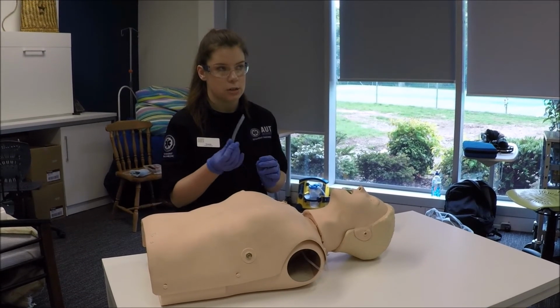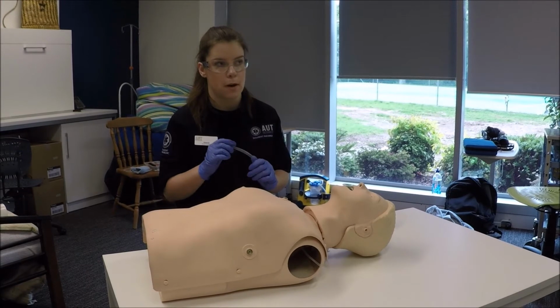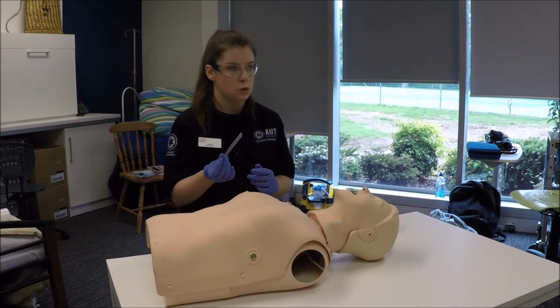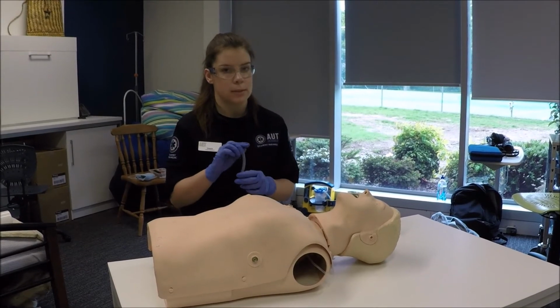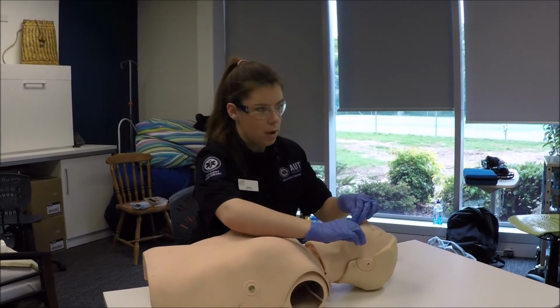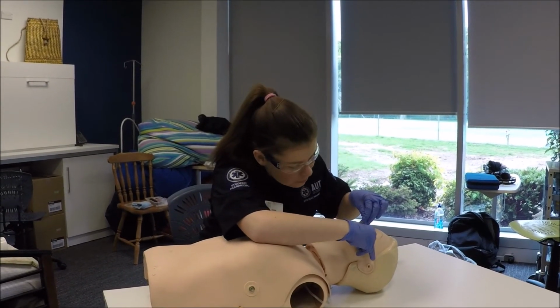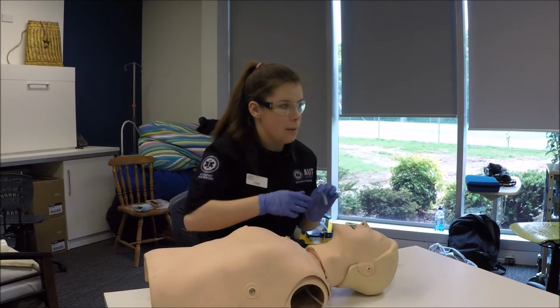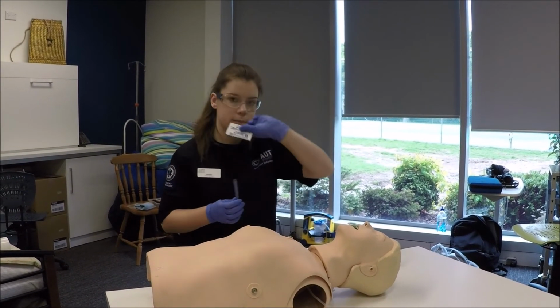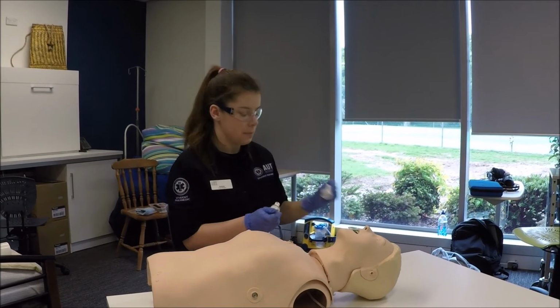Some contraindications for the NPA is if there's a severe head injury in case of base of skull fracture. Some complications include bleeding or nasal polyps. So to measure the NPA, we measure from the nostril to the earlobe, like this. Before we insert it, we lubricate it with a water-based lubricant, like this. But today we'll be using a mannequin-approved lubricant.